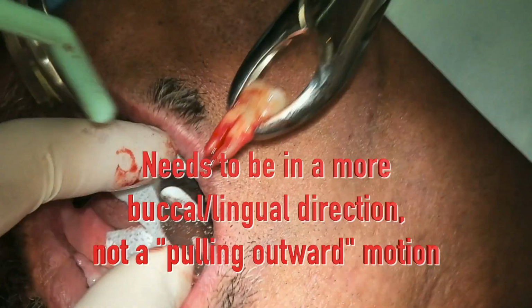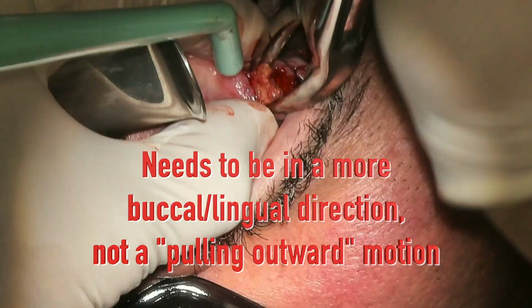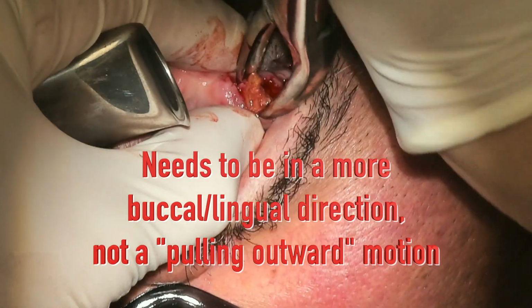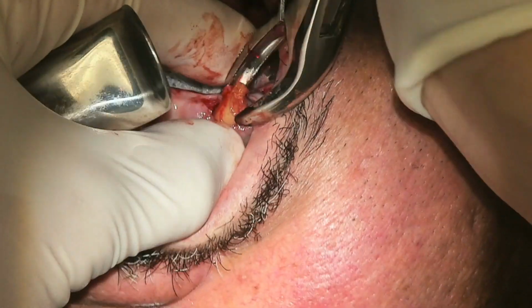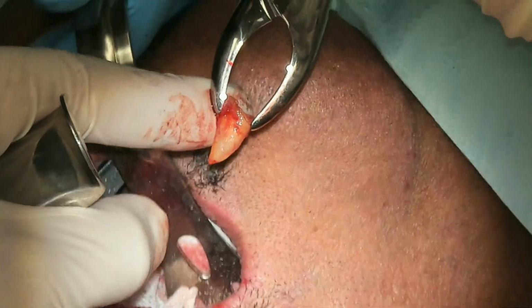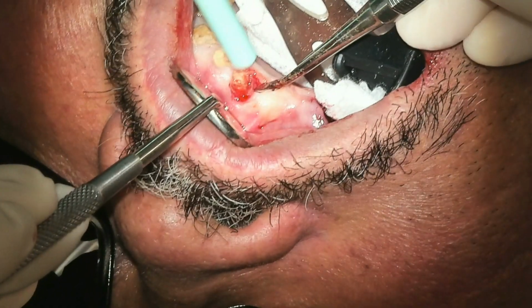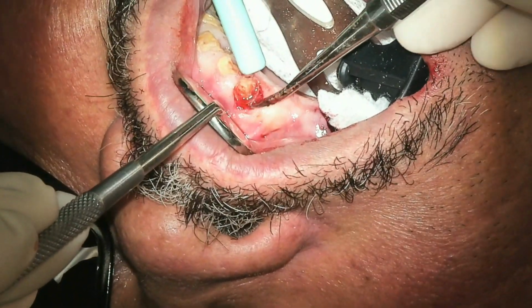There, the extraction was a little bit too forceful. It came out a little bit more unpredictable as you can see. So I went ahead and slowed down the buccal lingual direction of the extraction so it can be extracted in a more controlled manner. Fortunately, none of the root tips fractured off on that premolar.